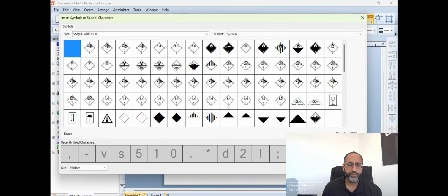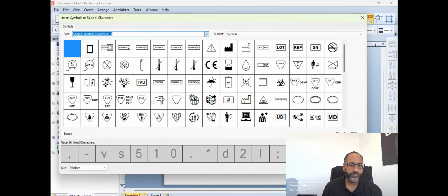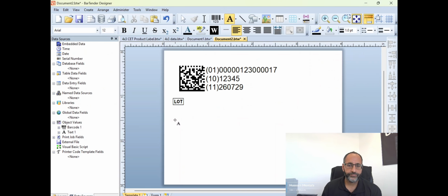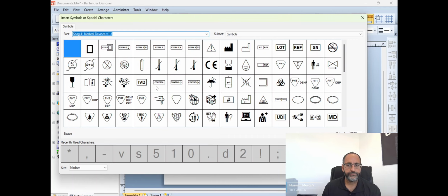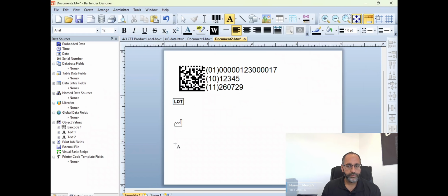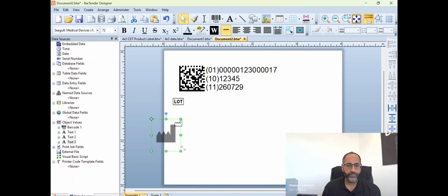We'll grab the production date one. Go again here, Seagull version 1.3. Production date symbol is, let's see if it's in here. Here it is right here. Production date. So we go ahead and add that one in there. Bring it over here. All right, let's go ahead and add another one. Let's go ahead and add manufacturer, where we could have manufacturer information. Grab that one.